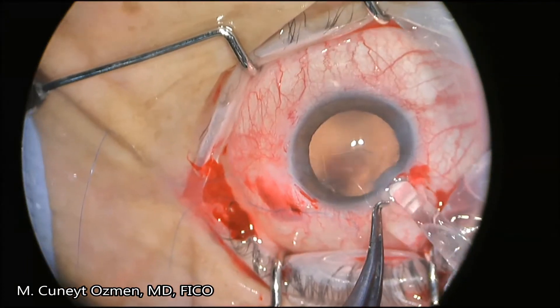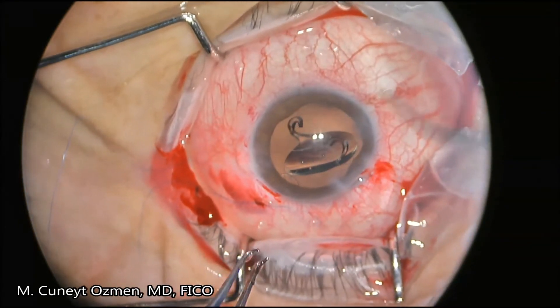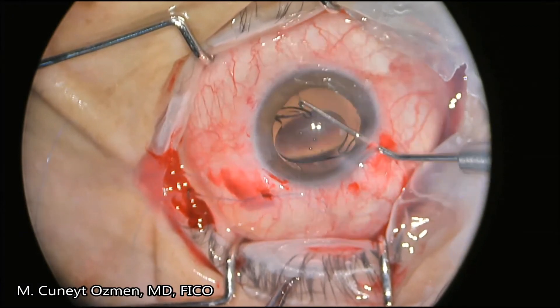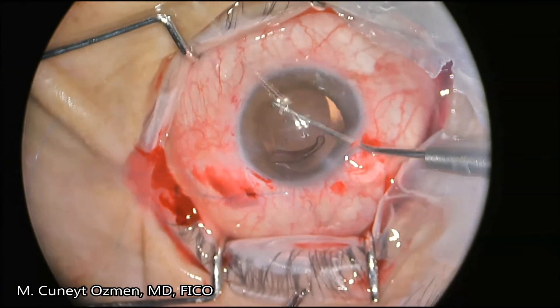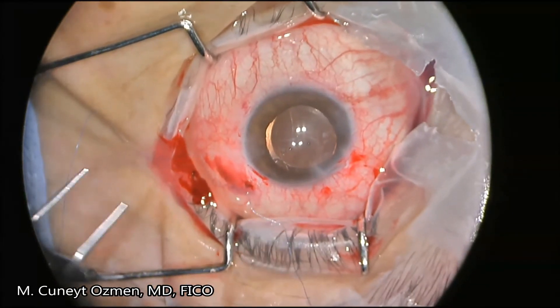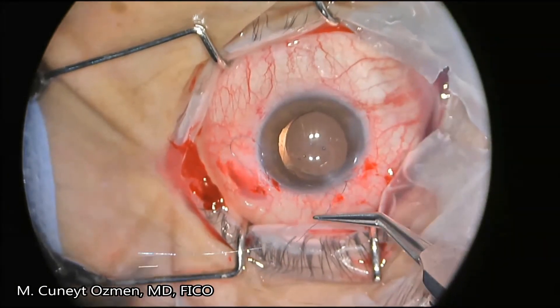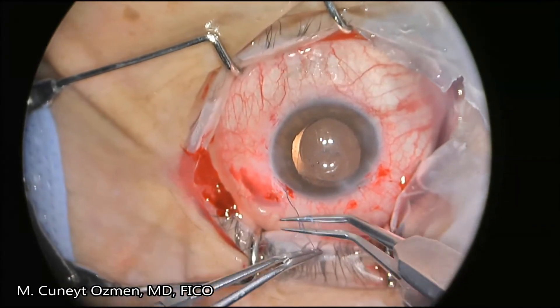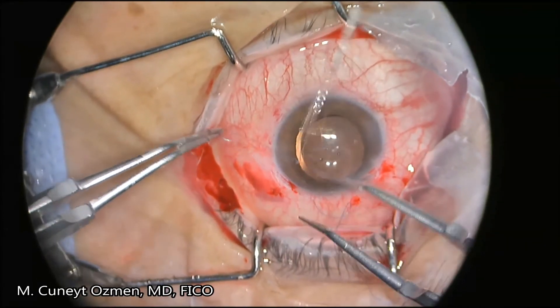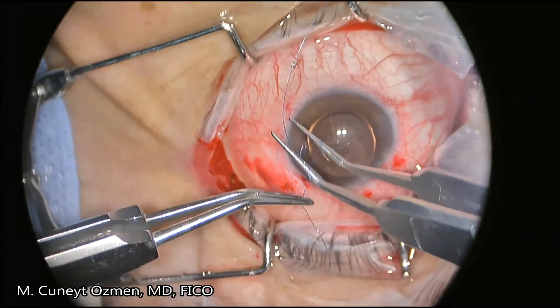For the final step of the phacoemulsification procedure, we insert an intraocular lens with the help of an ocular viscoelastic device. When the lens is in place, without removing the OVD, we are going to tie the sutures through the Hoffman pocket to stabilize the lens permanently. I'm now removing the sutures from the Hoffman pocket and tying them, making sure that the intraocular lens is centralized without tying them too tightly.